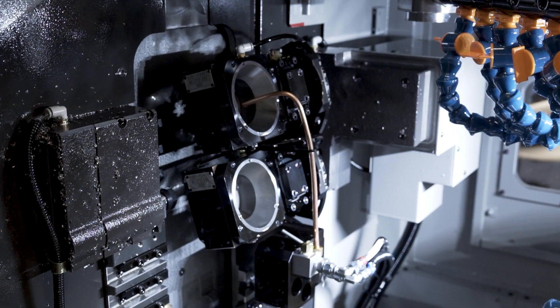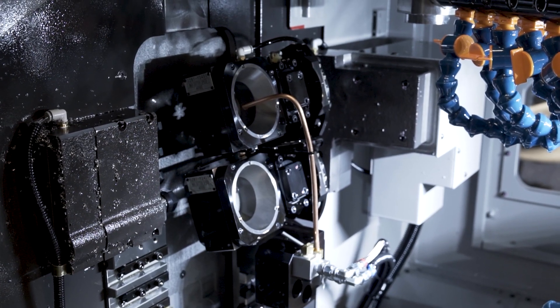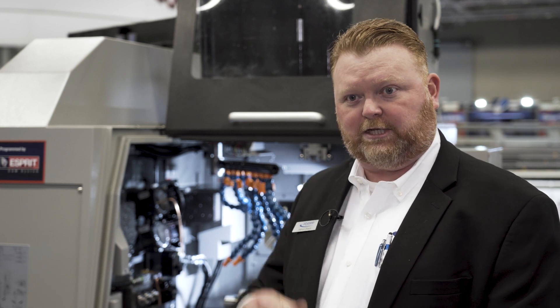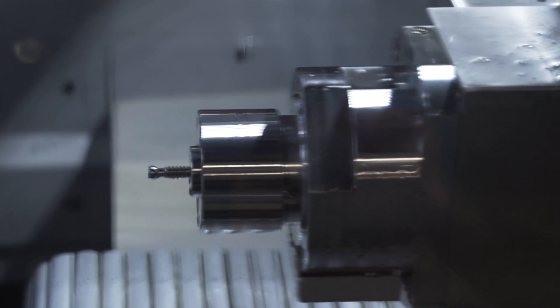Most medical screw threads are very deep thread forms with a lot of tool engagement, and they have a tendency to chatter and make bad surface finishes. With a whirling cut, since it's a milling cut, it's interrupted — the cutters each go in and out of the cut very rapidly and take small chunks of material out piece by piece. They don't make long continuous shavings; it makes nice short chips which are easy to process, and it's a much faster way of cutting a bone screw thread.